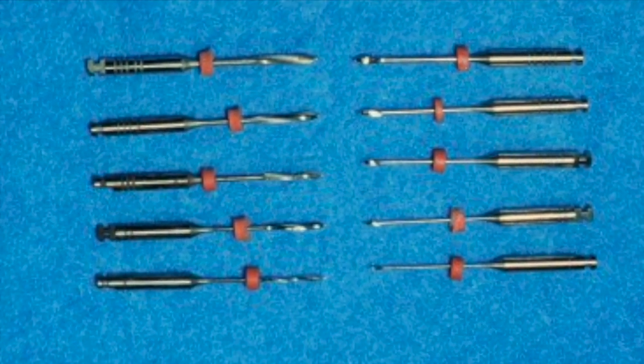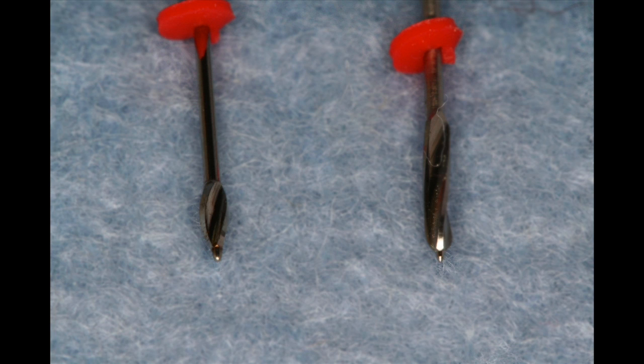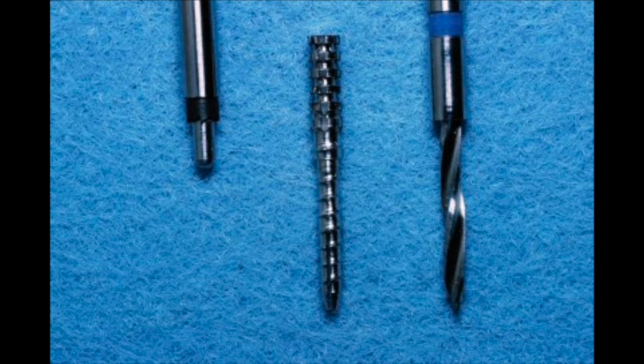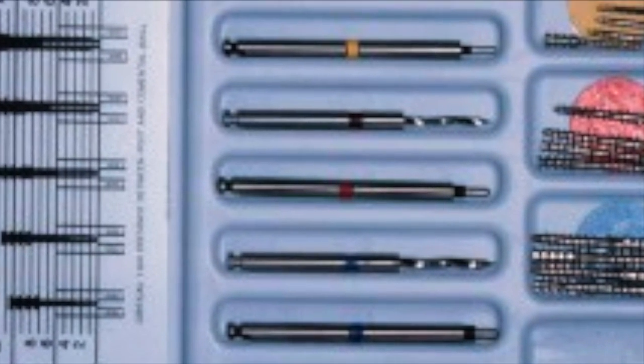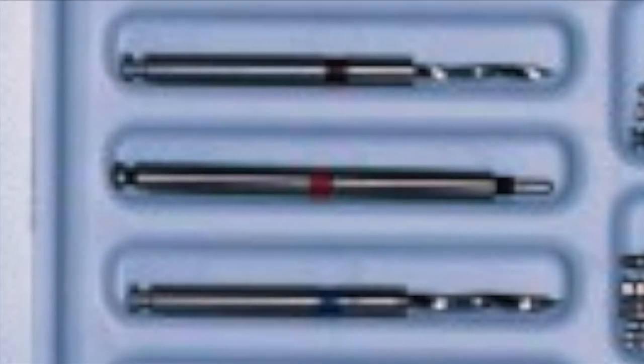Gates Glidden drills, piezo reamers, or other drills with non-cutting ends should be used to remove gutta percha. End-cutting drills should only be used after the canal has been cleared to the post length with a non-end-cutting drill. Otherwise, end-cutting drills can result in removal of dentin and possible perforation or weakening of the root.